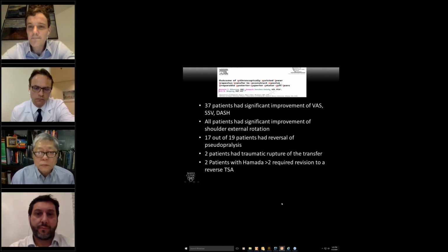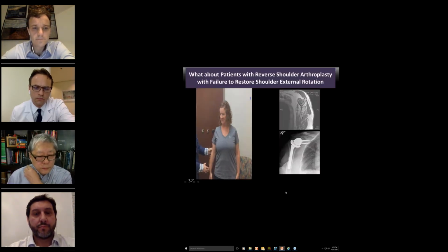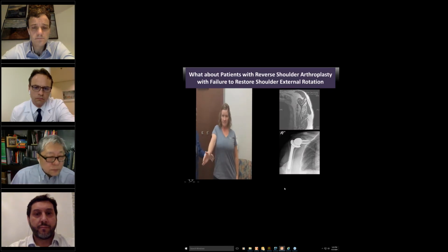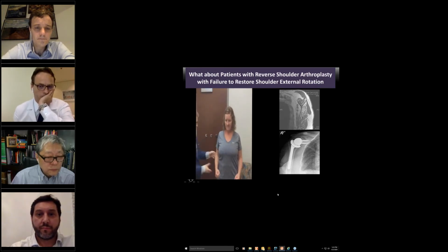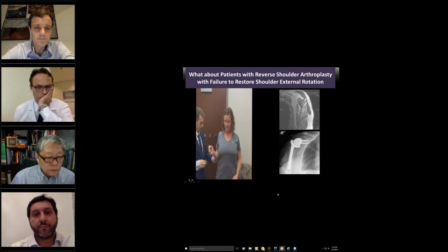Okay, because I thought this will give a perspective about what we have been talking about, lower trapezius over the past few years and in this meeting. And then I'm going to add another level of it. I get asked this question all the time. We're talking about deficient posterior superior rotator cuff, and I know a lot of surgeons rely on the implant to get them external rotation.